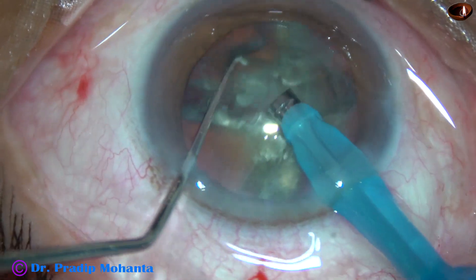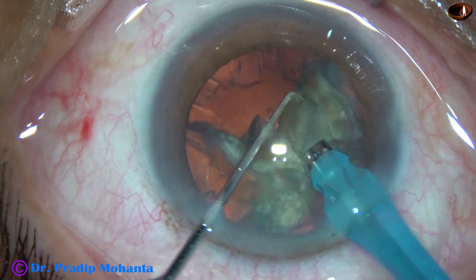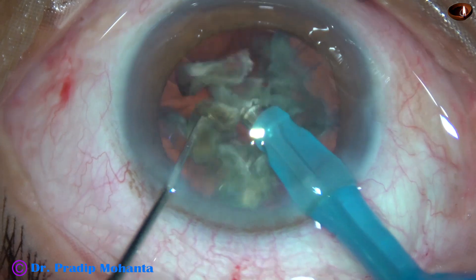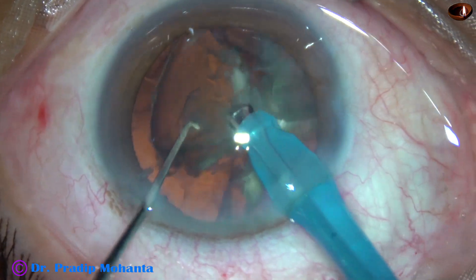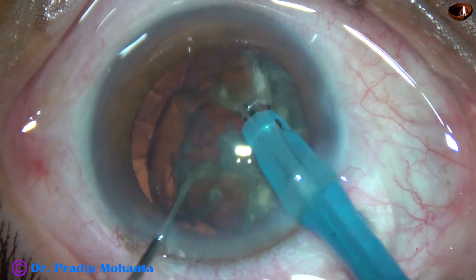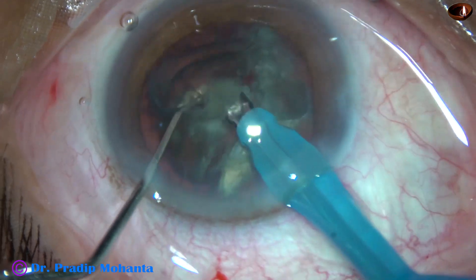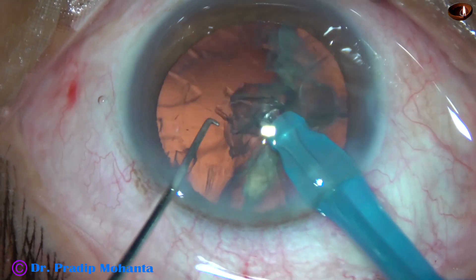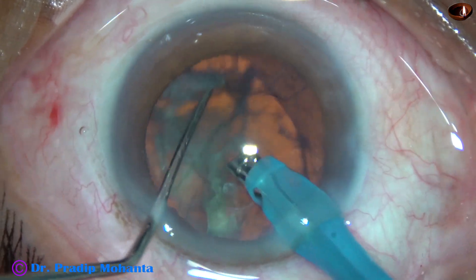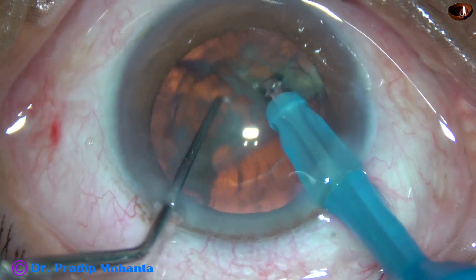Each nuclear fragment is subdivided into smaller pieces and they are emulsified with ultrasonic energy, which is 70% in this case. Flow rate is 45 ml per minute, and vacuum is 450 mm of mercury.